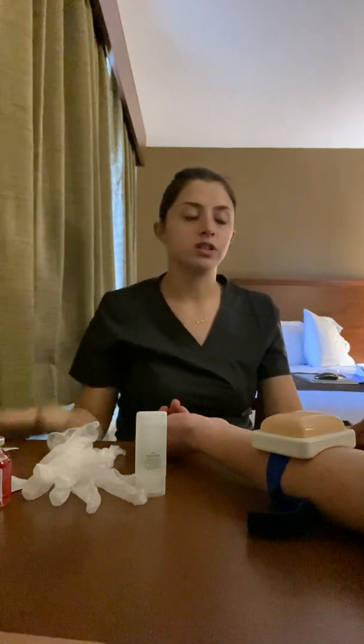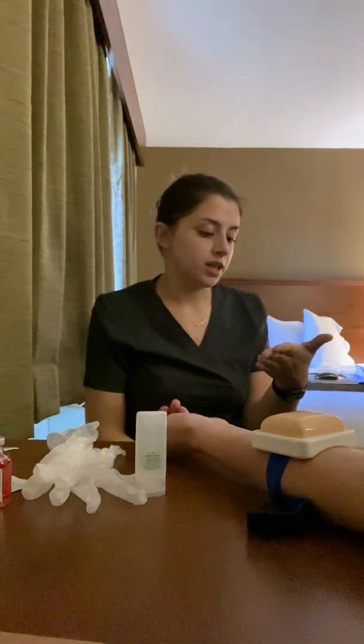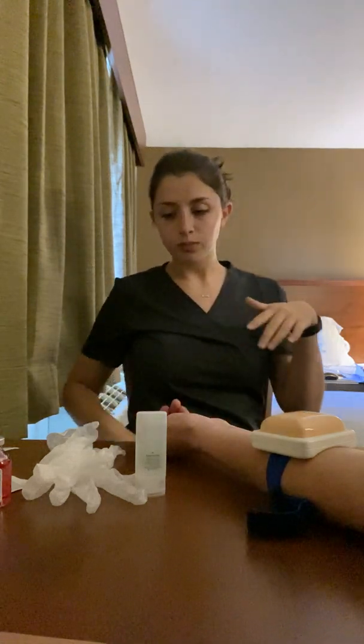Okay, so hi, my name is Brittany. I'm going to be your nurse today. I'm going to provide you with some privacy by closing the door. Can you please tell me your first and last name? Bridget Kaiser. Okay. And what is your date of birth? 7/8/77. Okay, you are the right patient. So, do you have any allergies, seasonal, medications, food, anything like that? Nope. Okay, so today I'm going to be giving you the TB skin test.